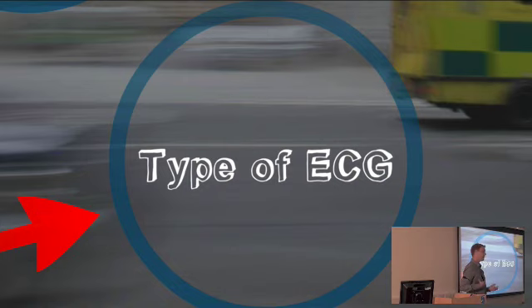Sometimes patients might be having a right-sided myocardial infarction, and you want to know about that. You know why it's important? Anyone know why picking up a right-sided infarction is important?